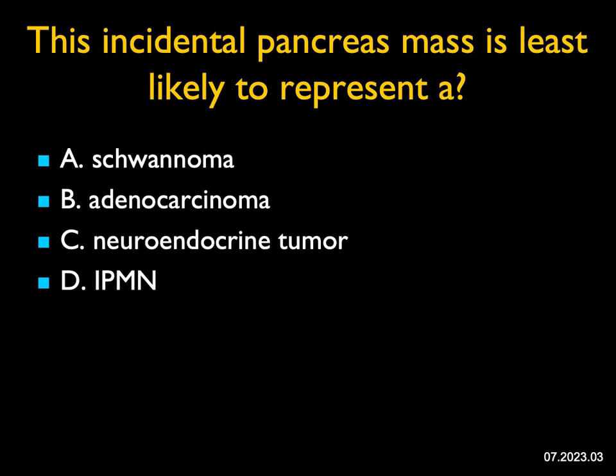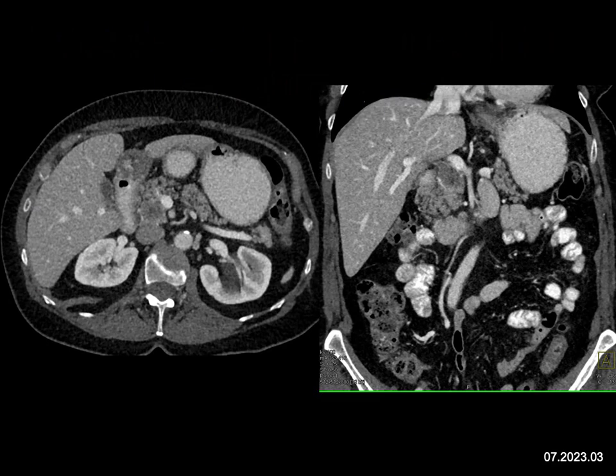This incidental pancreatic mass is least likely to represent — so what is this not? When we look on the axials and on the coronals, we see a hypovascular mass in the region of the head of the pancreas, and there does appear to be pancreatic duct dilatation. This could be an adenocarcinoma — that's probably the likely diagnosis normally. It could be an IPMN, but if it's an IPMN, I'd surely worry it's become malignant. We can see schwannomas, and occasionally we have seen low-density masses in the pancreatic head looking almost like carcinoma that turn out to be schwannomas.